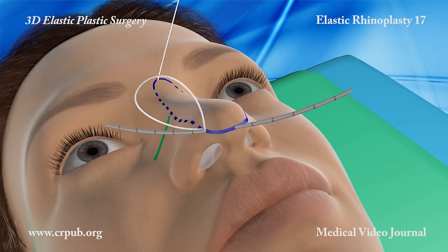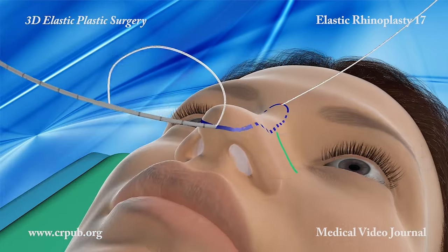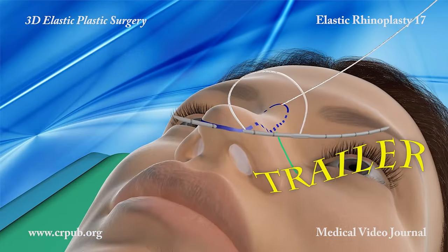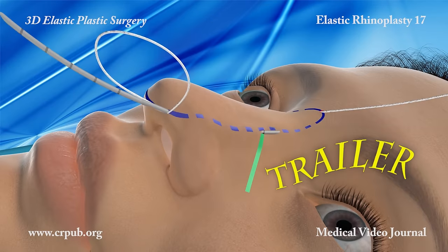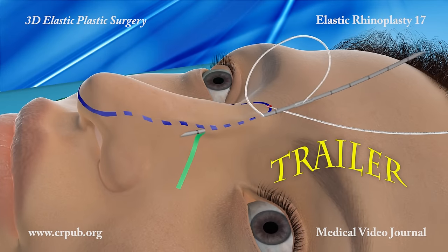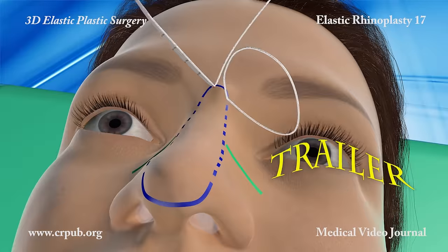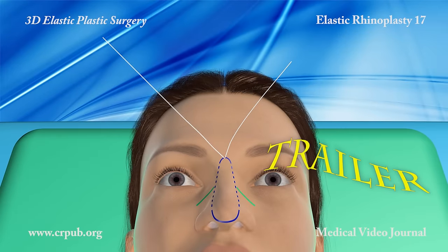To facilitate the passage of the needle between the skin and the cartilages, the assistant uses a 2.5 ml syringe to inject a solution of local anesthetic immediately beneath the skin. The needle then anchors the thread to the deep tissues of the procerus and exits through the small incision.